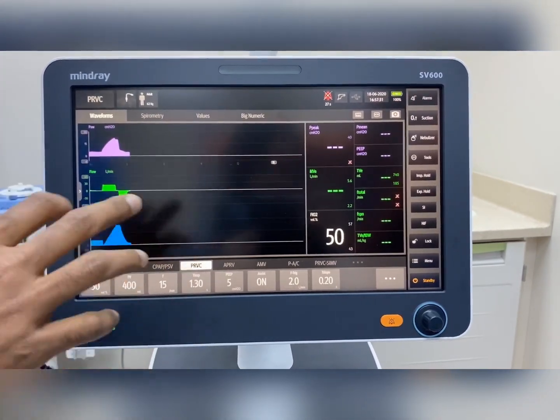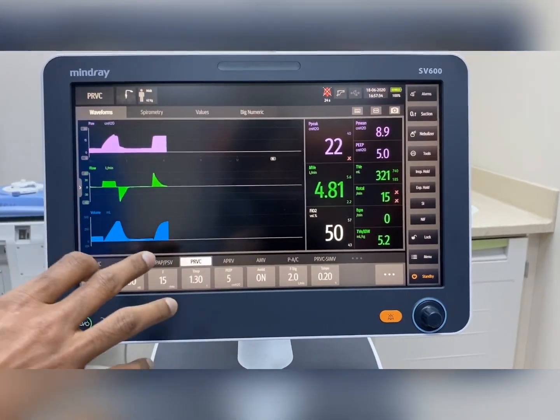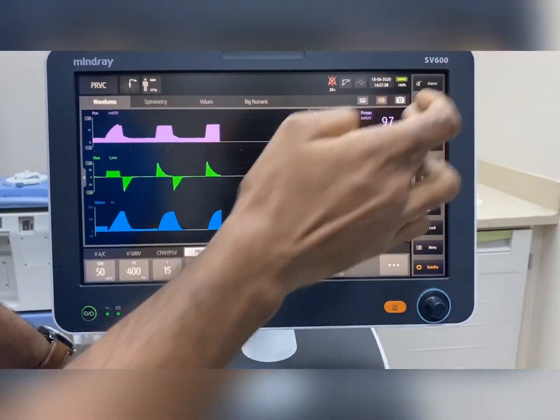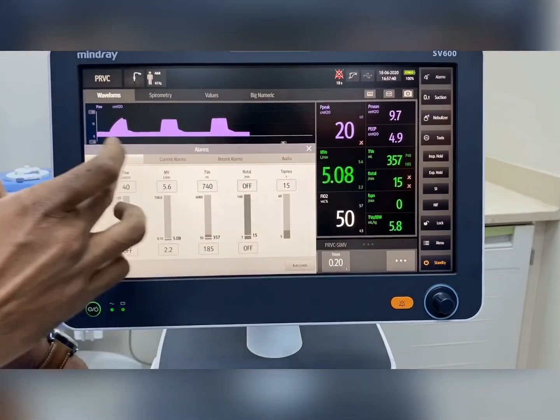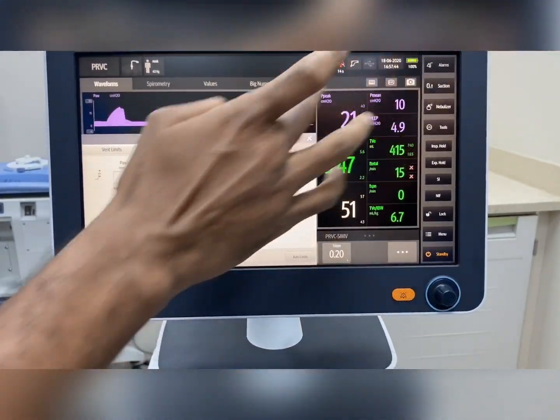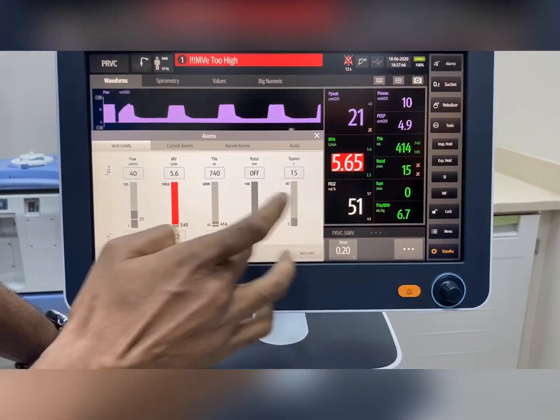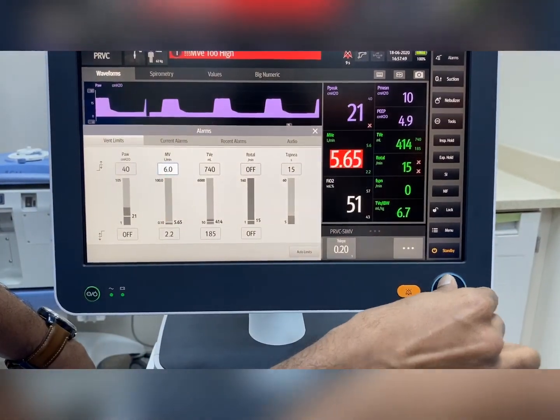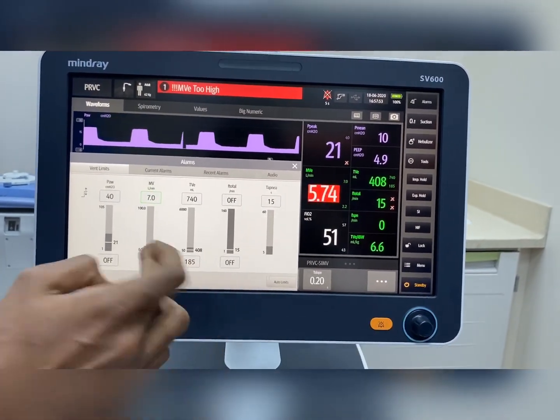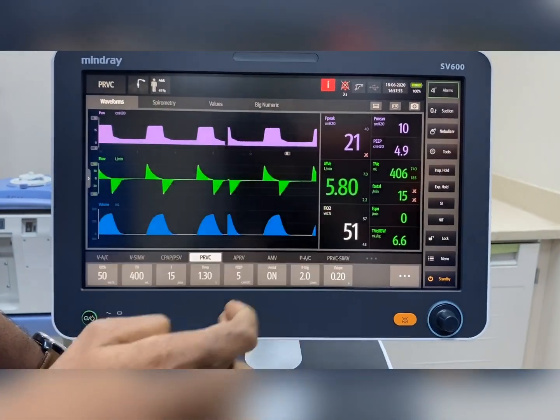The machine is now running with the basic mode we usually use in the ICU, which is PRVC. For alarm options, all the basic alarms are here: pressure, minute ventilation, tidal volume, rate, and apnea. The alarms can be adjusted — according to the minute ventilation, we can set the alarm accordingly. All alarm adjustment is easy.